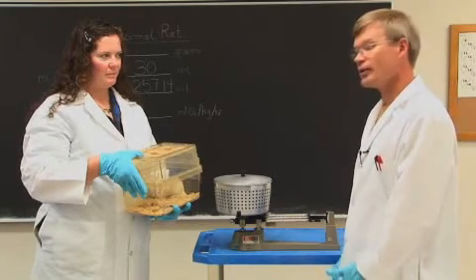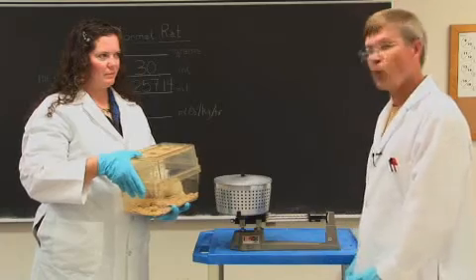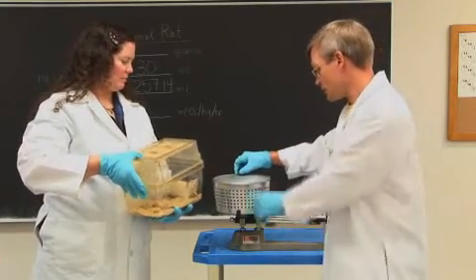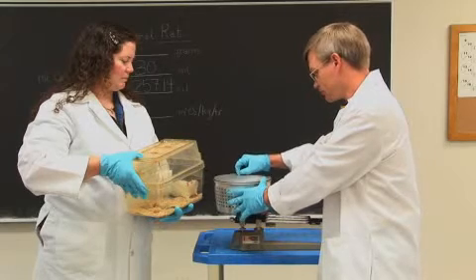In order to calculate the metabolic rate, we now need to know the weight of the rat. So we will determine the weight of the rat as the next step.